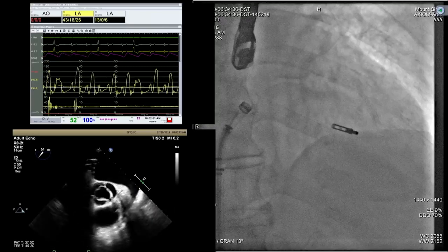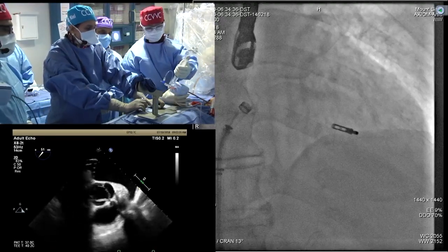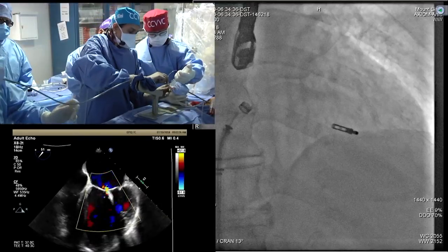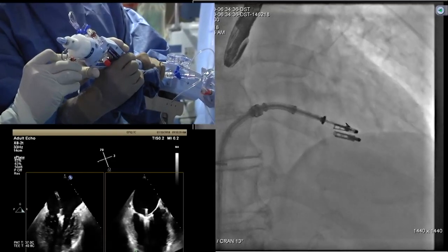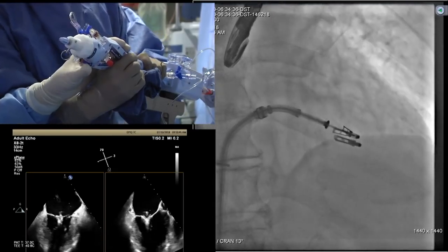Okay. You want to check another gradient, Gila? Was one before? It was two after, please. Okay, two is okay. It's a very important point that anything above five, you're not going to go up. So we are going to introduce the second clip now. Go on live there. Show the third screen. Good. Okay, ready to grab. Dropping now. ACT is 309. Good. Okay, now. 60. Close now.